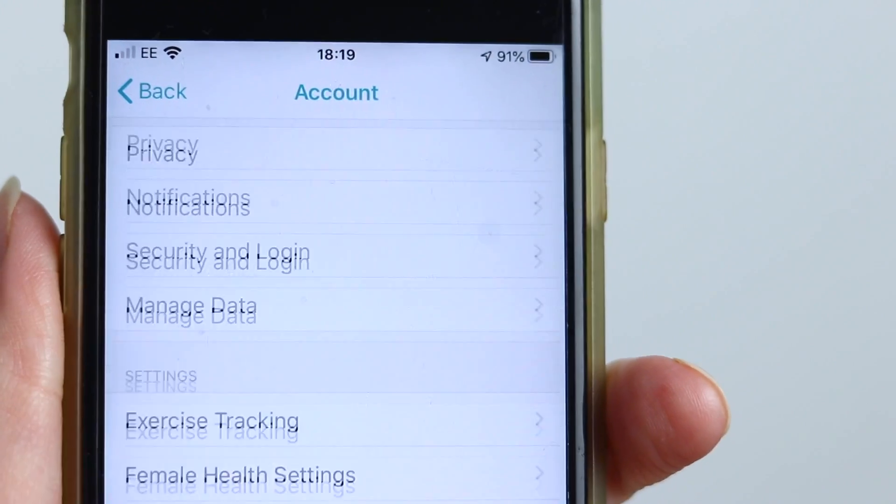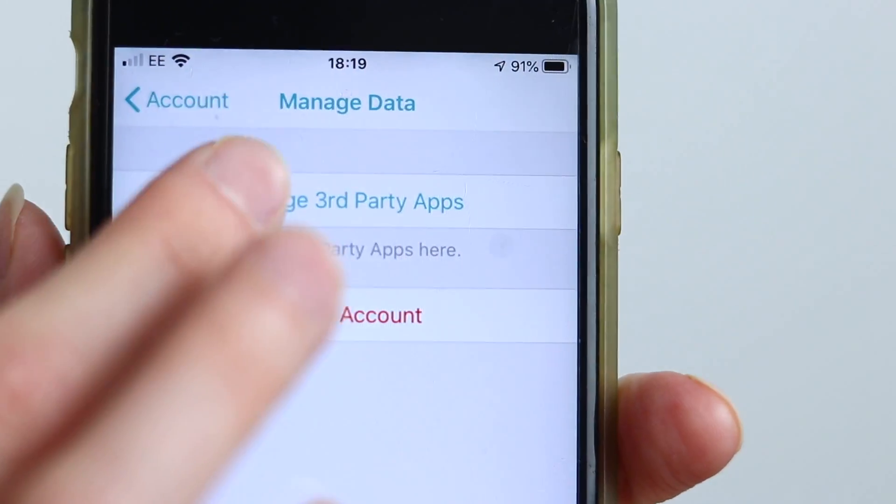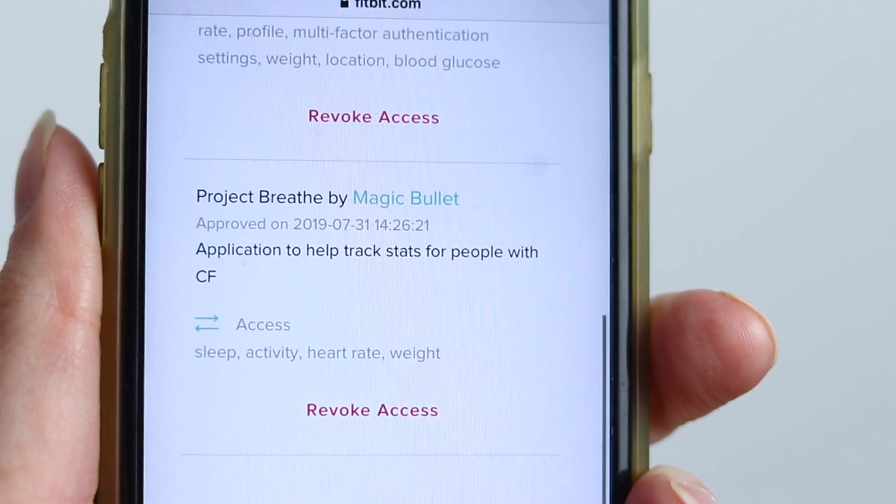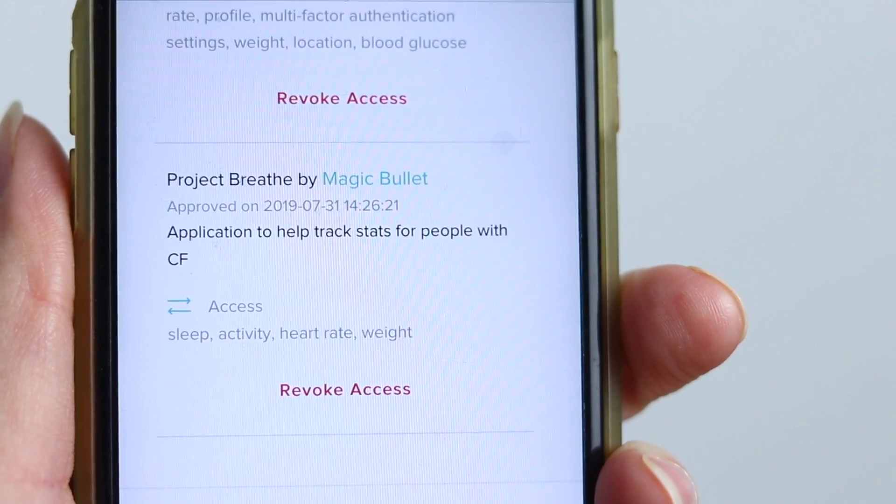While in the Fitbit app, here's another thing to quickly check. When you first connected Breathe to your Fitbit account, you were asked if it was okay for Breathe to access your data. If you're not sure this was set up correctly, tap the top left icon, scroll down, and choose Manage Data, then Manage Third Party Apps. You should see Project Breathe in the list, and it should show that you've given Breathe access to your sleep, activity, heart rate, and weight data. If it all looks okay, great — but if not, tap the Revoke Access link and set it up again from scratch. There's more about this on the Breathe website, linked at the end of this video.